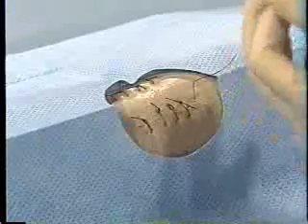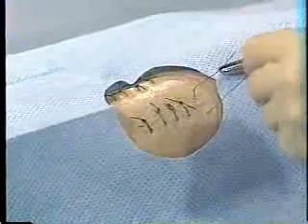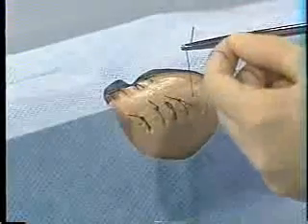Also, it's not usually necessary to steady the needle with the pickups. After completing the stitch, it's time to do the instrument tie.